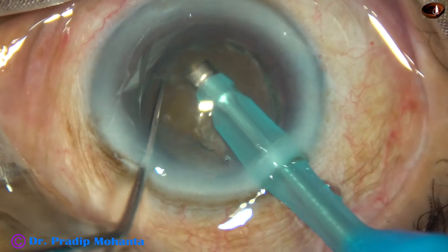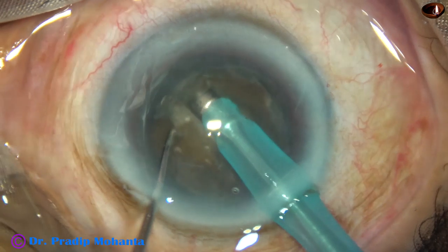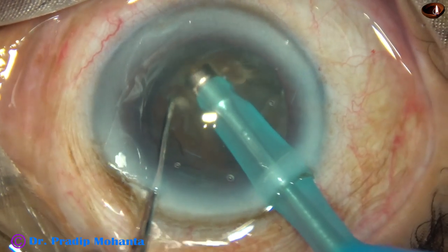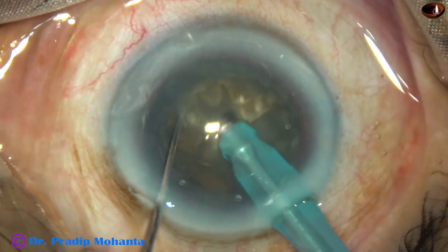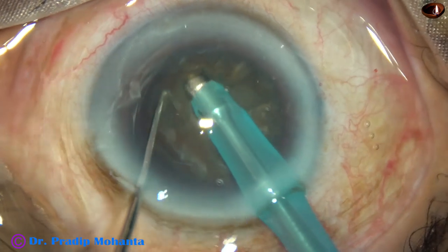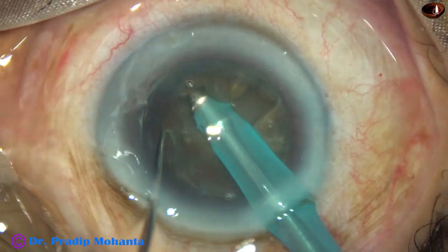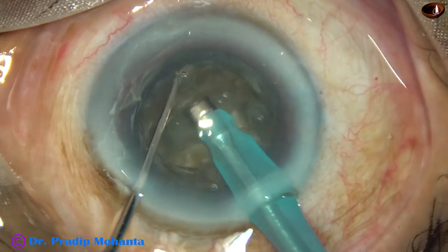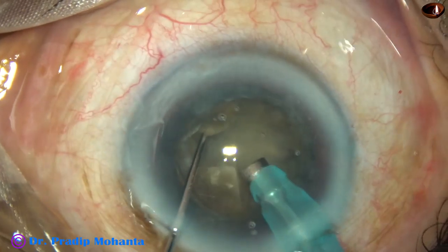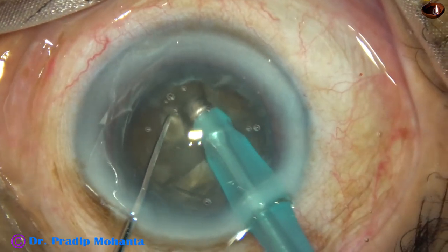Now I start sculpting. One thing we must remember is that we must not push the nucleus. We must sculpt and move, sculpt and move. As much sculpting has been done, that much movement should be forward. Otherwise, we will just push the nucleus and cause zonular stress. So sculpting and moving forward should be of the same amount. Suppose you have sculpted one millimeter, so you move forward one millimeter. Otherwise, you will push the nucleus forward.